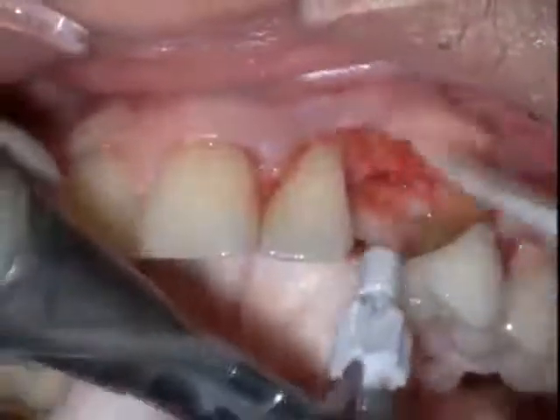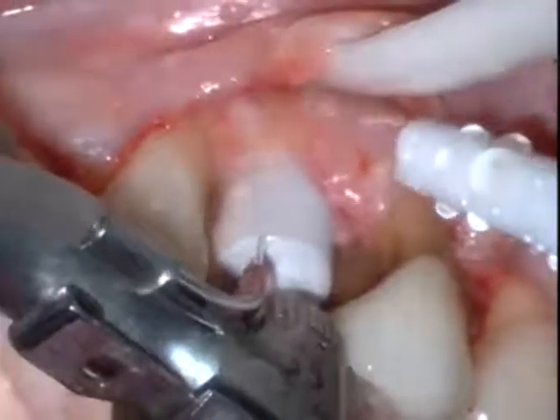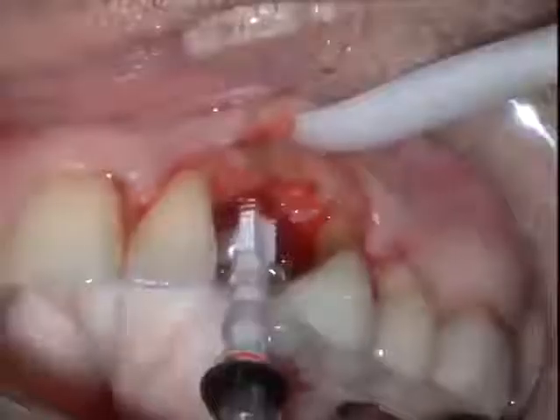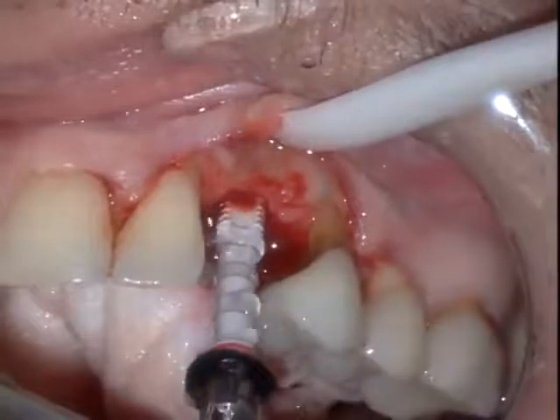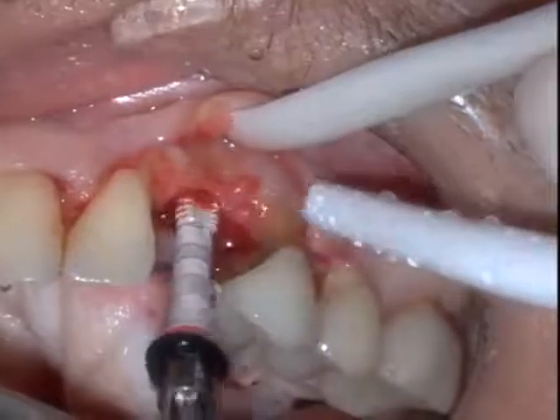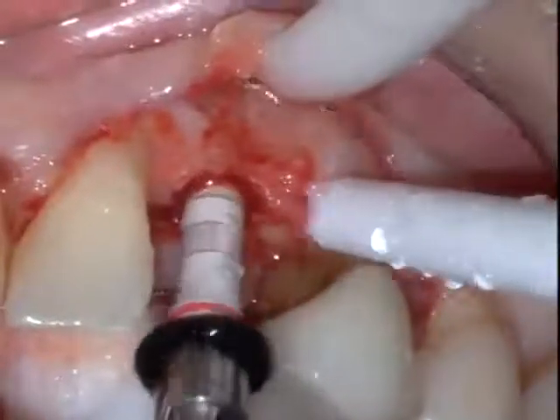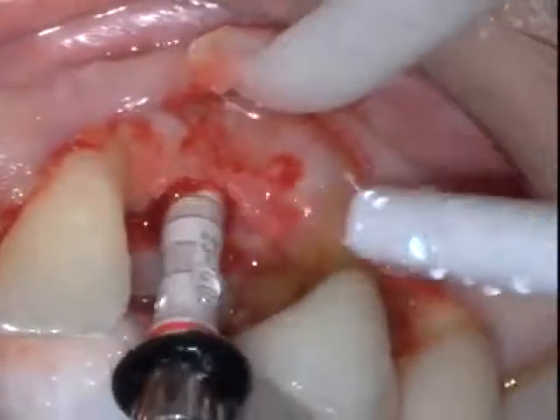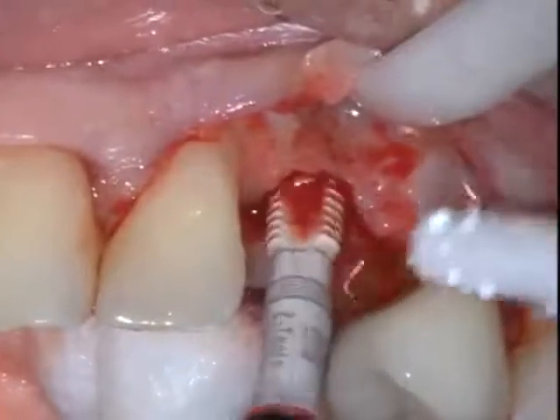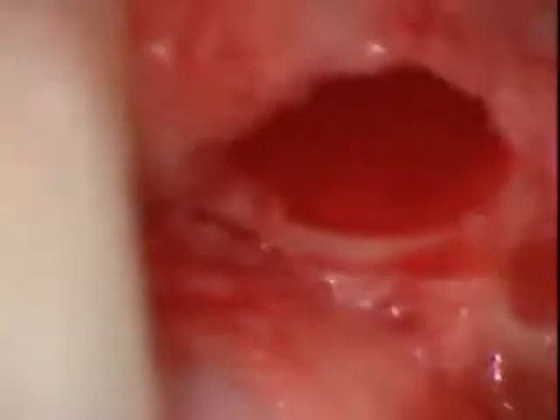We go down to approximately 13 millimeters, keeping the implant towards the palate, and then utilize the countersink drill, as you can see here, which is extremely important to locate the platform of the implant. A bone tap is then utilized, made of zirconium, to thread the inner aspects of the bone for the future placement of the implant. And as you can see here, once the bone tap is utilized, we can then back it out very slowly, and now we have an ideal implant recipient site and osteotomy prepared. And you can see on higher magnification, the threads have now been cut.